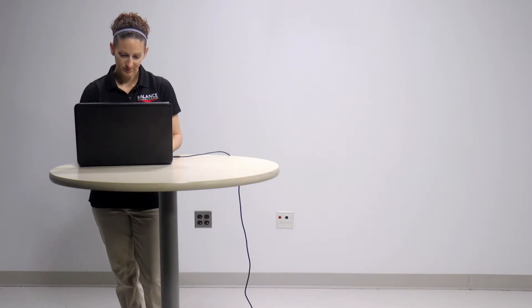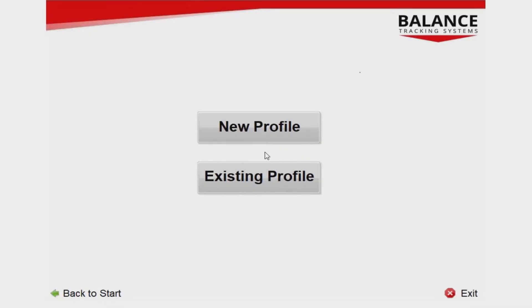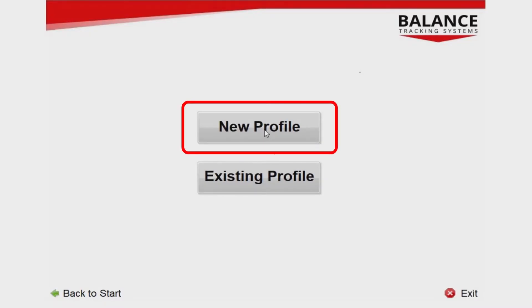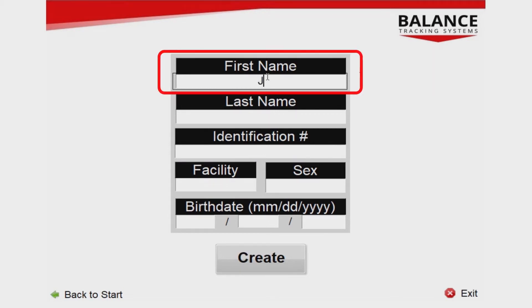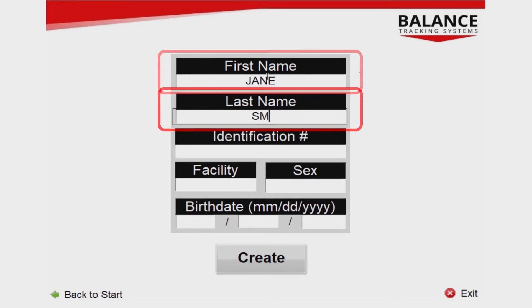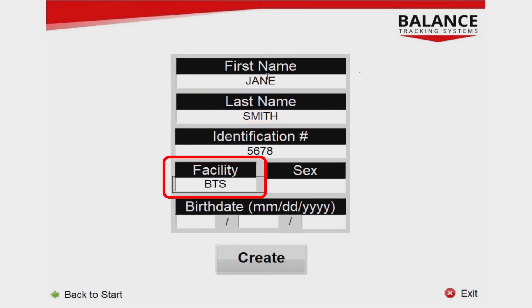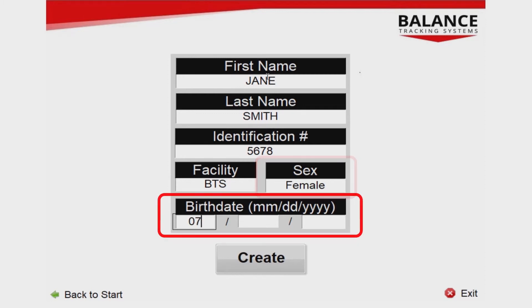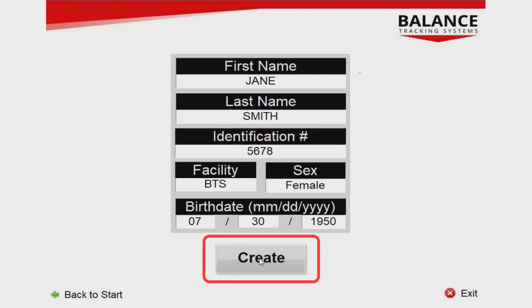Next, you must create or select an existing profile for testing. To create a profile, press New Profile. You will be taken to a screen where you can enter the first name, last name, identification number, facility, sex, and birth date associated with the person being tested. Once all fields are completed, press Create.